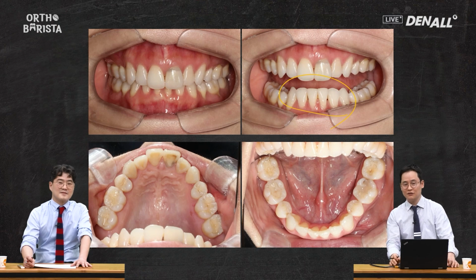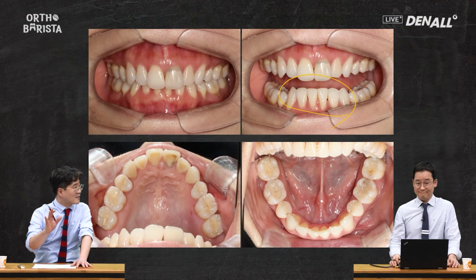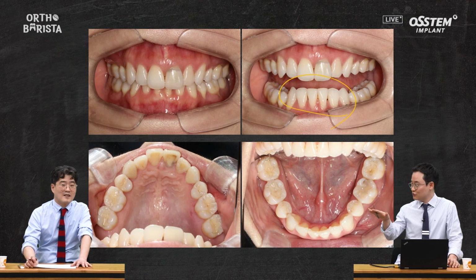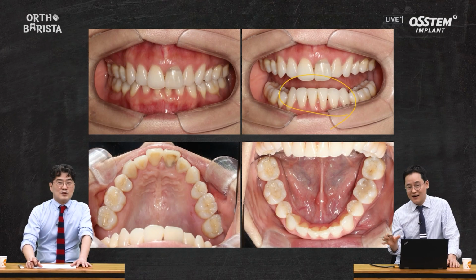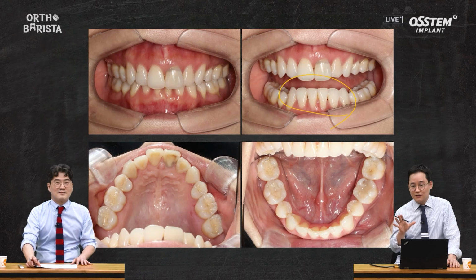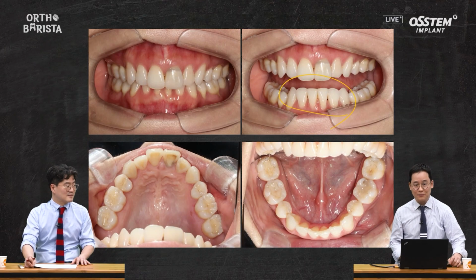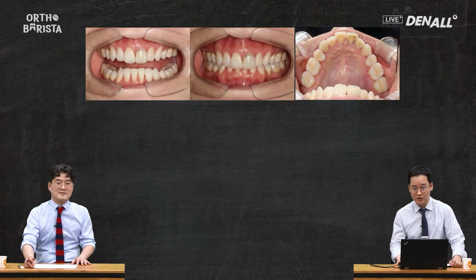For example, in this case, clear aligner treatment was used for 4 months. Was it applied only to the maxilla? Well, the mandible was also treated, but you can't only think about the maxilla in such cases. Even if clear aligners were worn for 4 months, removable retainers have to be used for 4 years. It could be a situation that the patient cannot understand. So always ensure to assess whether retainers can be placed securely.